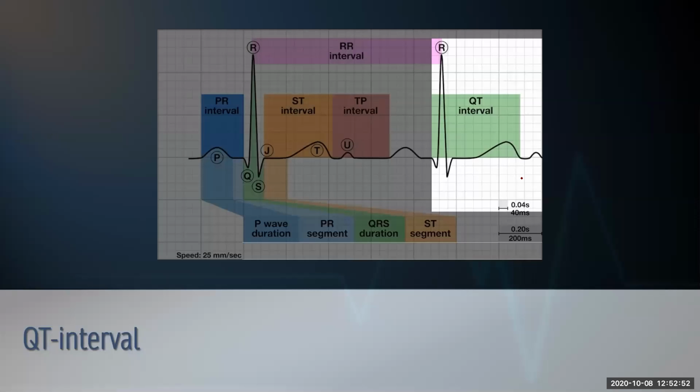So that is it on access. I think we started at PR, we went through blocks, and then I just finished off R, which we talked about with the QRS, but I mentioned the fragmented with the R. So QT, do you guys want me to try and go through QT right now, or do you want to save it for the next time?